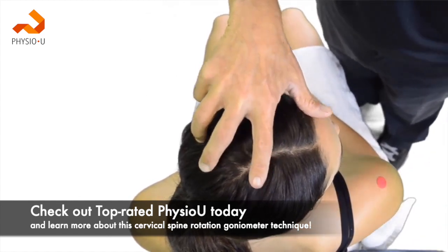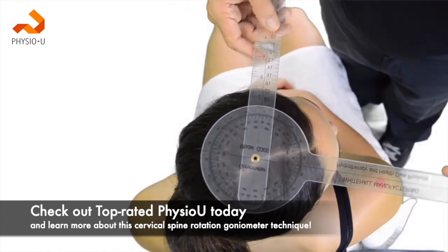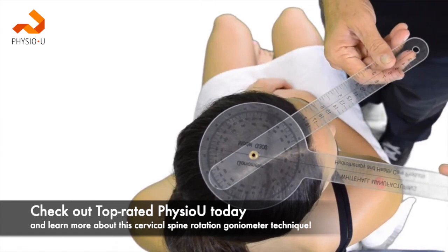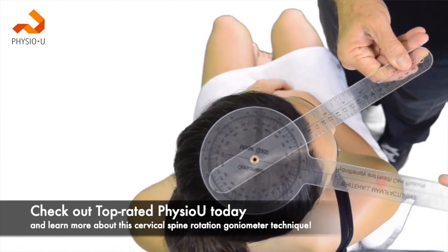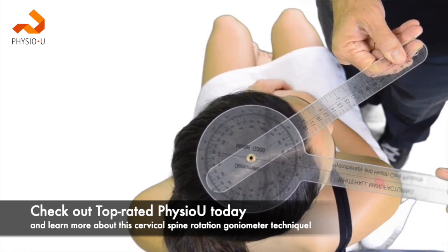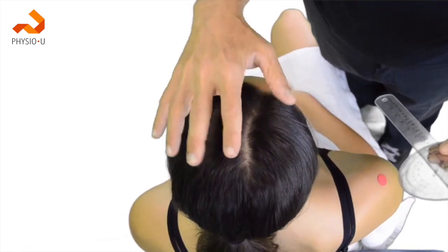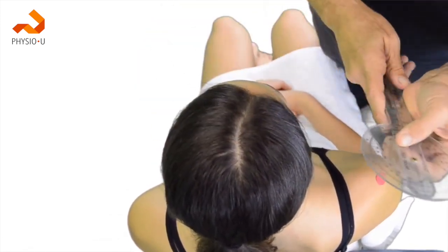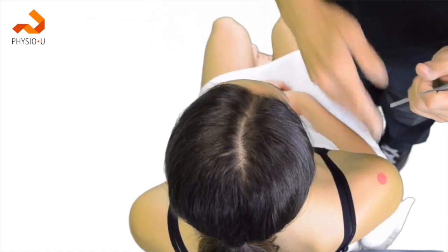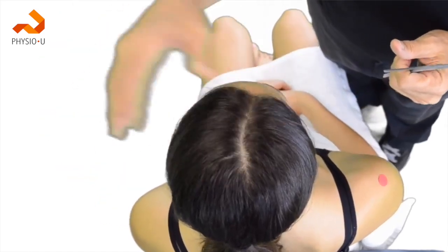I would then take my goniometer and align it over the landmarks as we discussed. The measurement gained would give us an indication of right cervical rotation. We would then perform the exact same procedure utilizing the left acromion, and that would measure for left rotation.